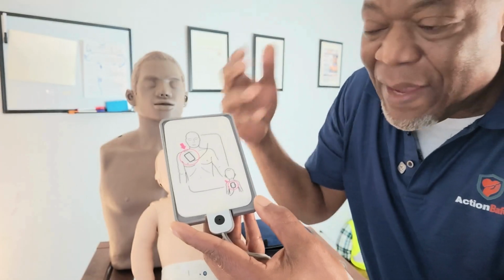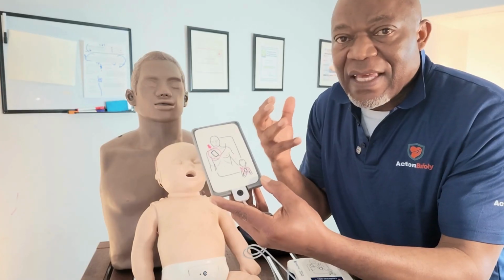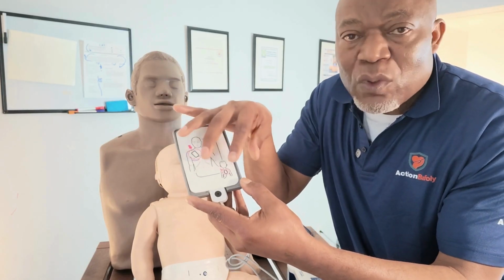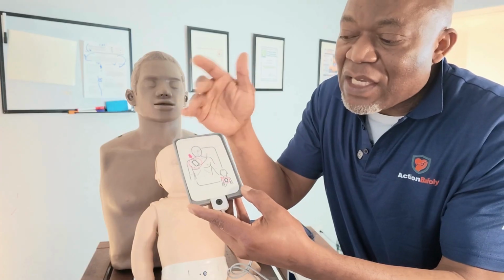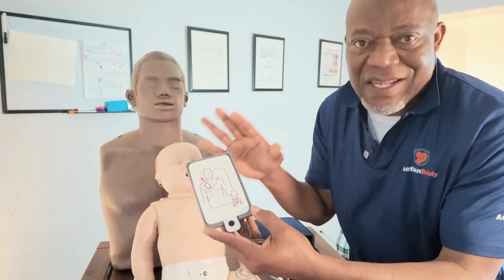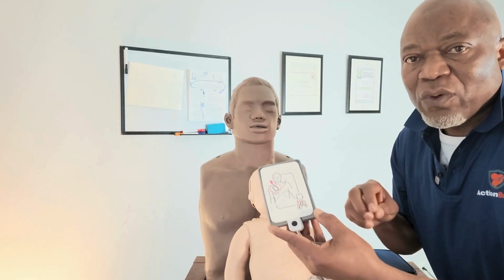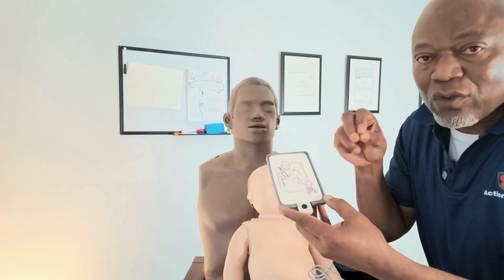It simply means that when you pick up an AED, simply pay attention to what it is showing you as a directive, whether it's an image or writing, that will help you properly. So you don't need to panic when you take an AED at your workplace. It's completely simple to follow the process.